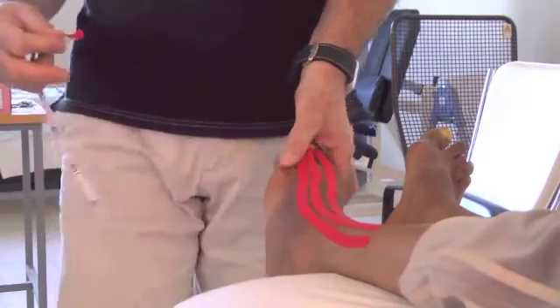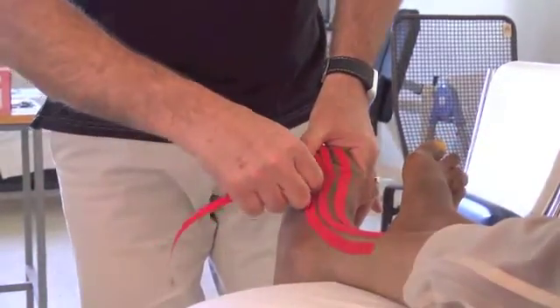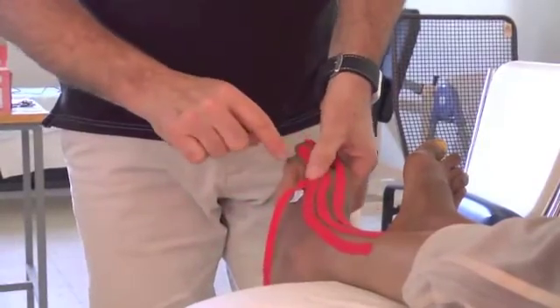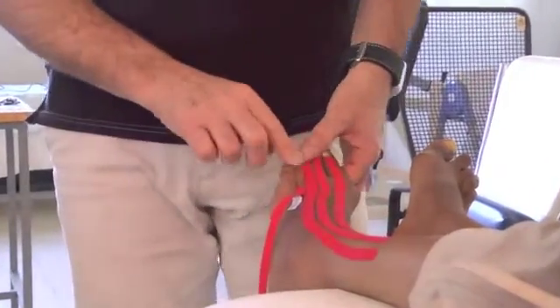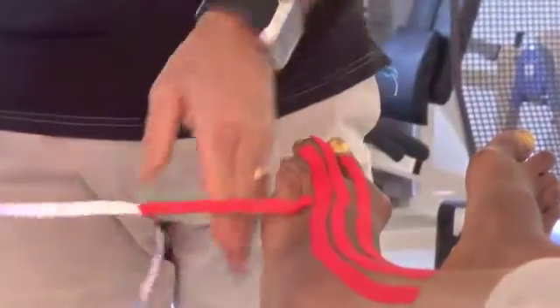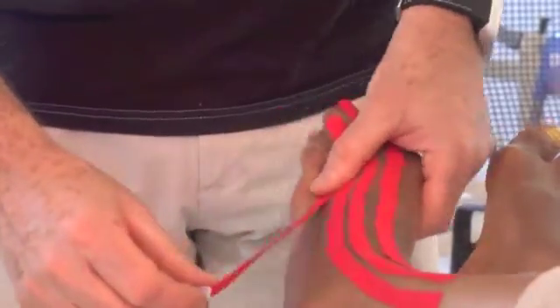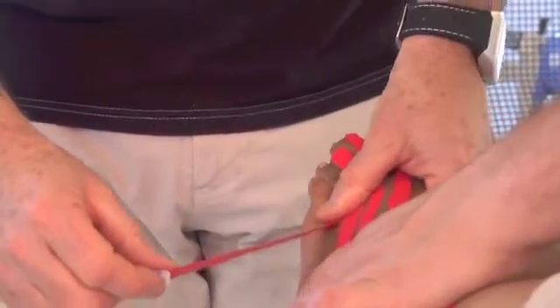Here it's starting to get very rigid. So we're going to start at this point because it's going to be too difficult to apply the tape on the top of the toes. Progressively, as the patient gets better, progressively we can change. So here — plantar flexion in inversion.